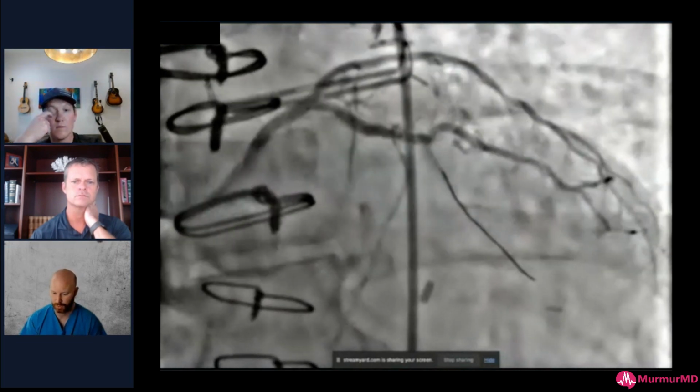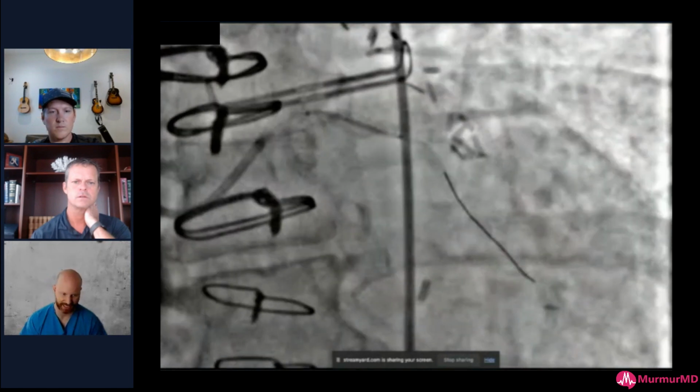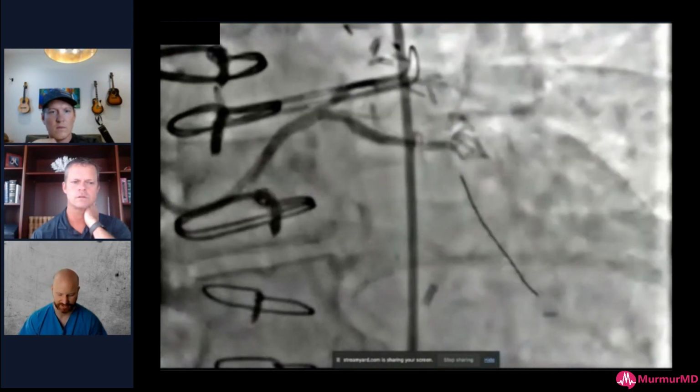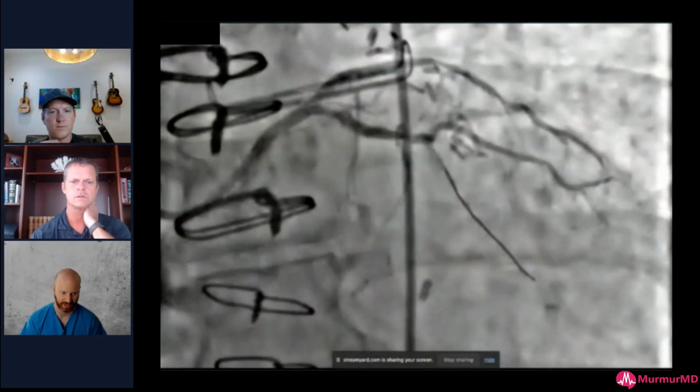And since they're so one-to-one adjacent to the guide itself, it's sort of just acting like a dilator. So if the guide does slip in some, it's just going to slide on the guide extension. It's not going to do any ice cream scooping of anything or really cause any trauma. And so that's something I like to use when I have one in.